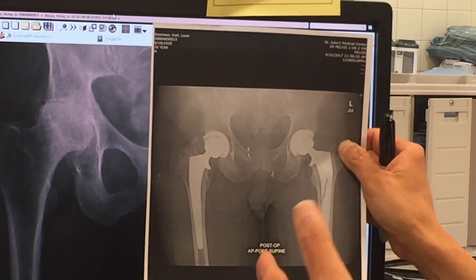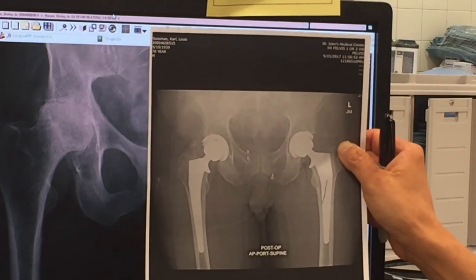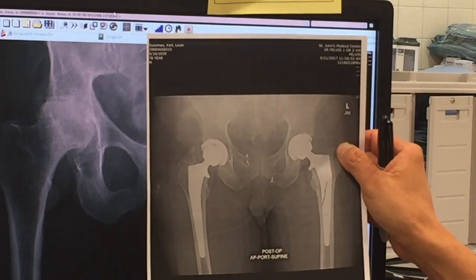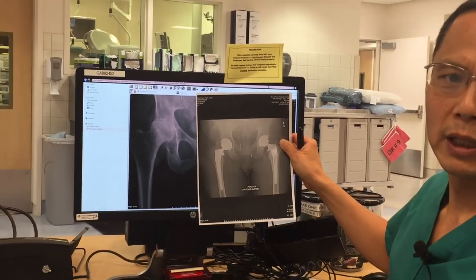X-rays are actually pretty straightforward, and I think with just a little bit of knowledge, you too can make that diagnosis of arthritis in your own radiograph.